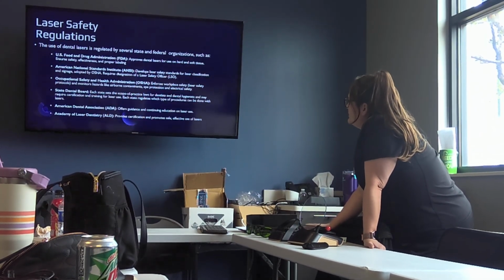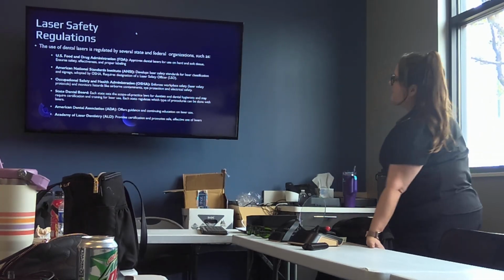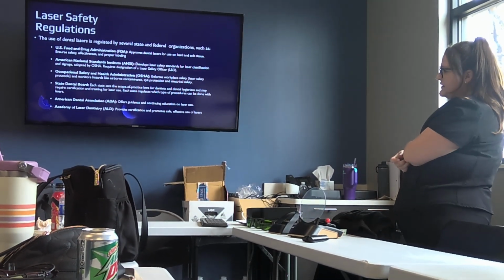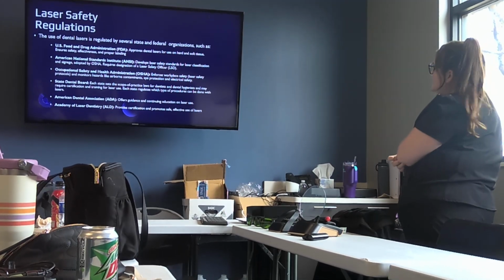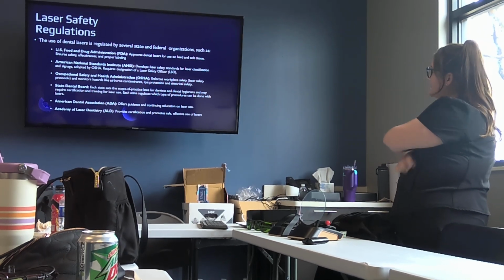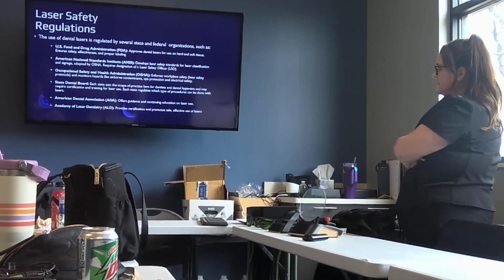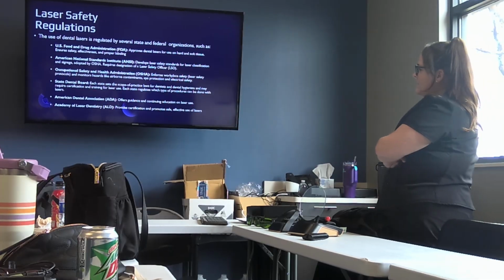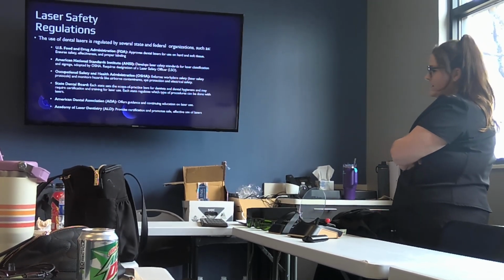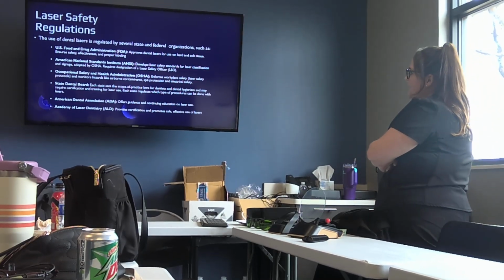And then some of the safety regulations. The use of dental lasers is regulated by several state and federal agencies. The FDA helps approve the lasers for use on hard and soft tissues. They're the organization that ensures the safety, effectiveness, and proper labeling of the lasers.